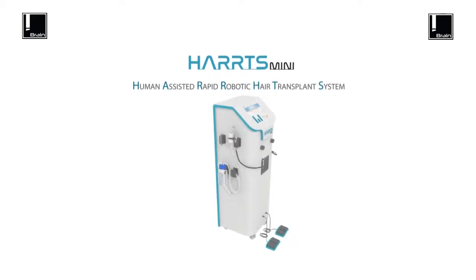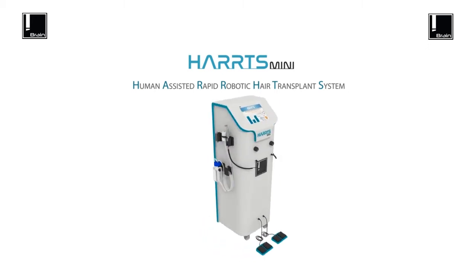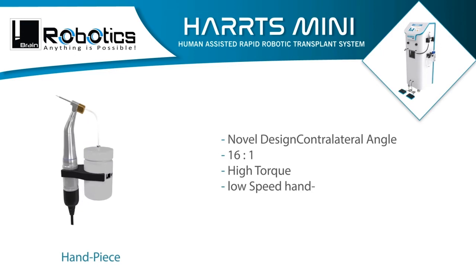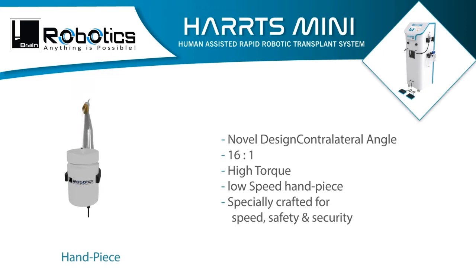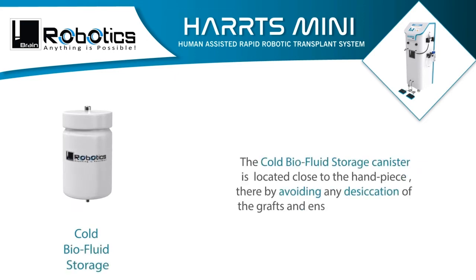Introducing HARRTS — Human Assisted Rapid Robotic Transplant System — revolutionizing the way hair transplants are done worldwide. Novel design with a contralateral angle, 16-to-1 ratio, high-torque low-speed handpiece specially crafted for speed, safety, and security. The cold bio-fluid storage canister is located close to the handpiece.